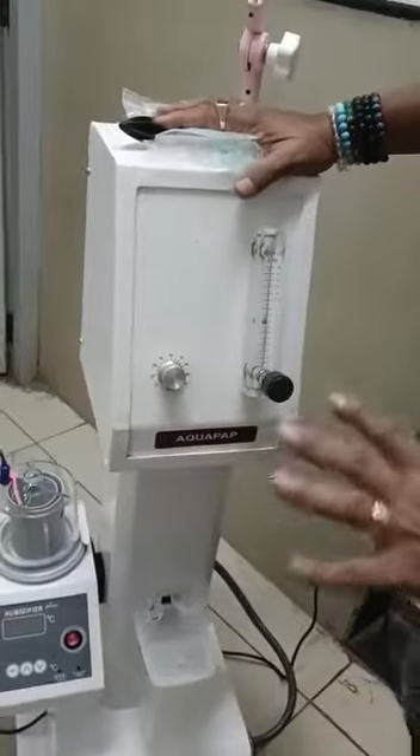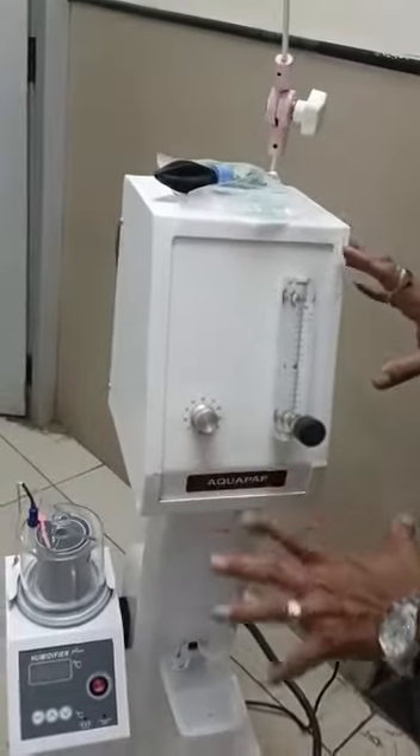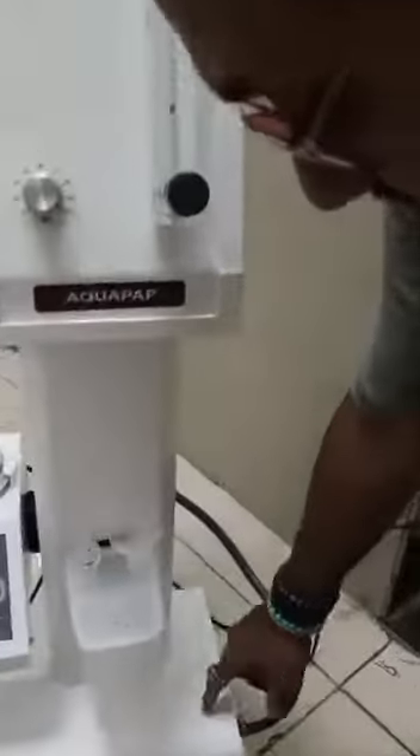This is AquaPAP, Bubble CPAP. This is the unit. It comes with an inbuilt air compressor.